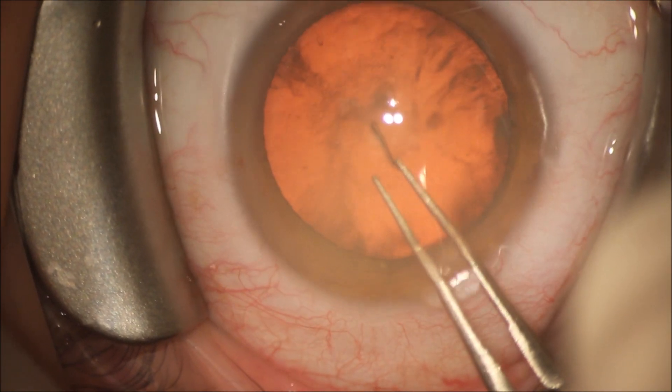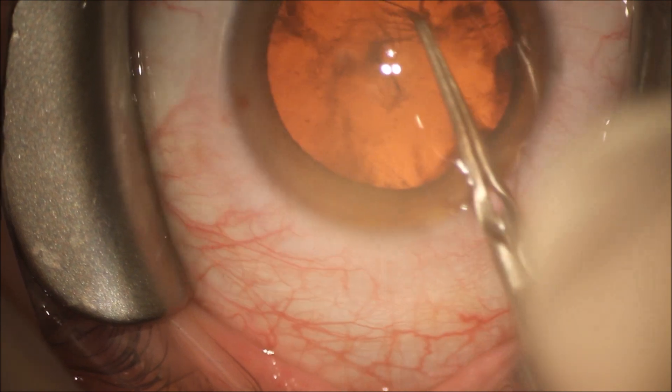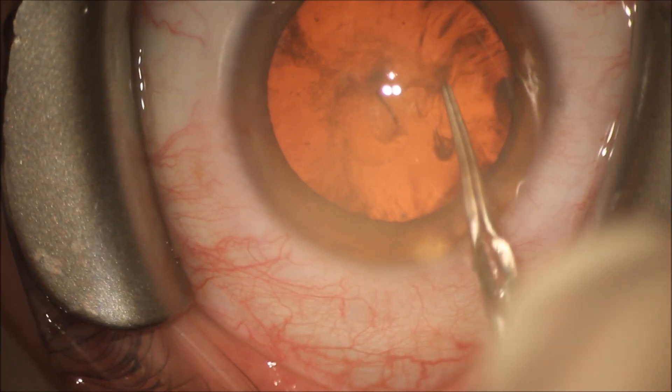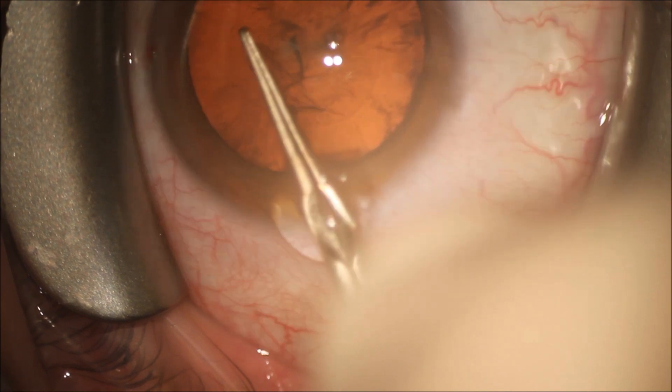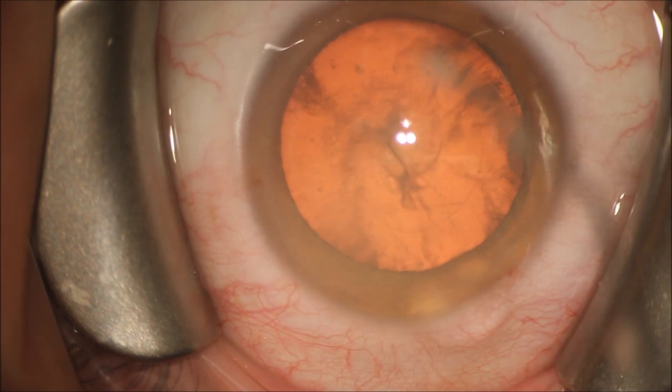We're going to perform a capsulorrhexis using a standard capsulorrhexis forcep. We make a tear into the anterior capsule, and we keep it about 5 millimeters for a multifocal lens implant.